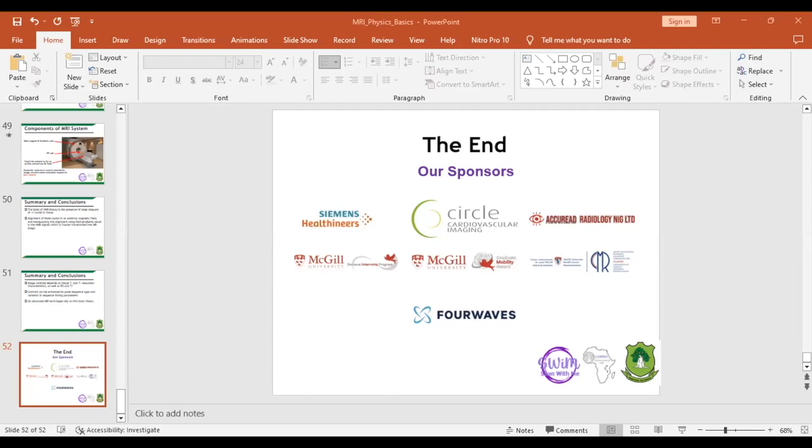Once we are able to identify the optimum sequence parameters to use, you can try them first on healthy participants or volunteers to see how those parameters would work. But before we even start to build or create protocols, you might want to start from phantom studies and then move on to apply on humans.